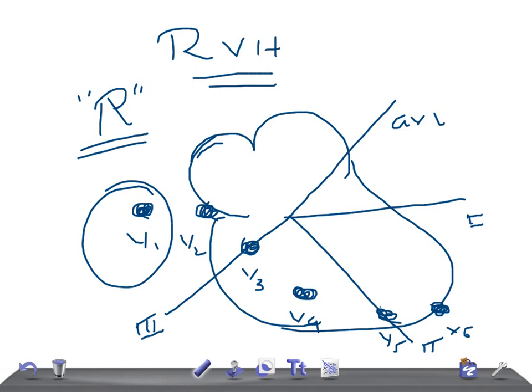Remember, right ventricle hypertrophy is also associated with right axis deviation. That's really very important. In a previous video we uploaded how to identify the cardiac axis very quickly and easily. Right ventricle hypertrophy is also associated with deep S waves in leads V5 and V6.